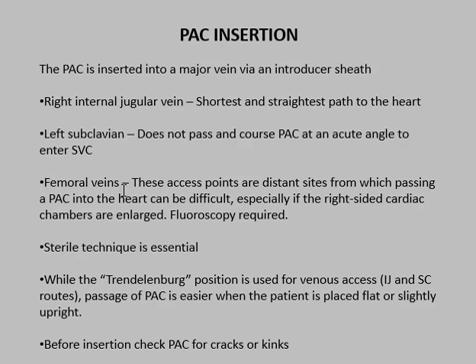The femoral veins are most commonly used in the cath lab. We are used to these approaches and we can access them very quickly. However, they can be a little more tortuous.